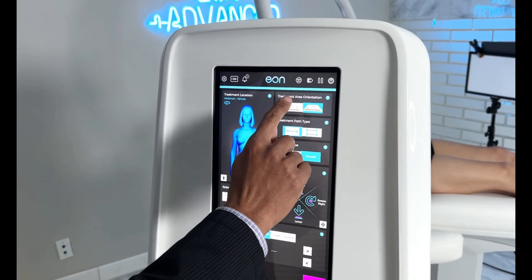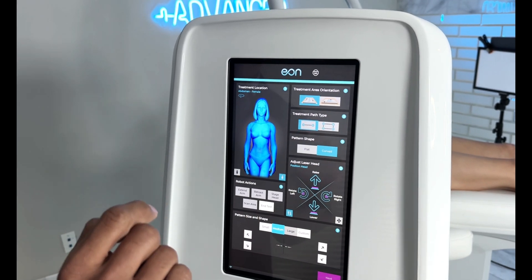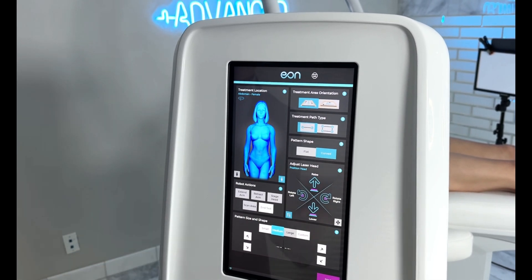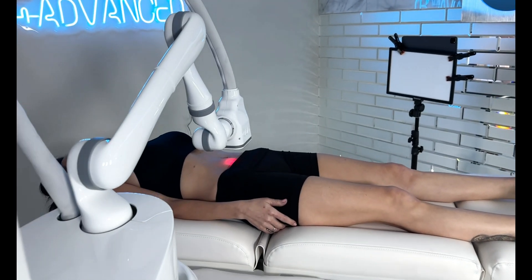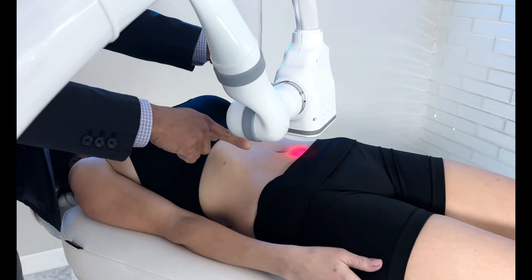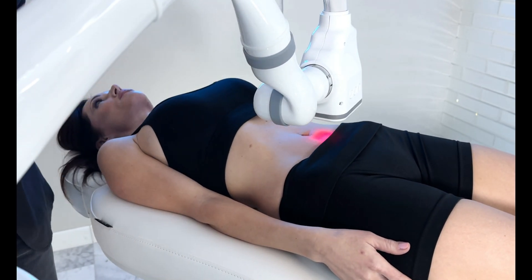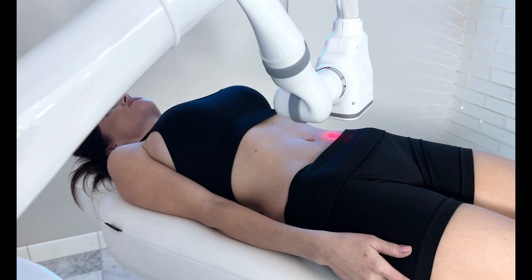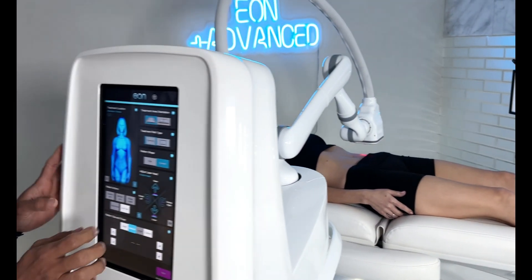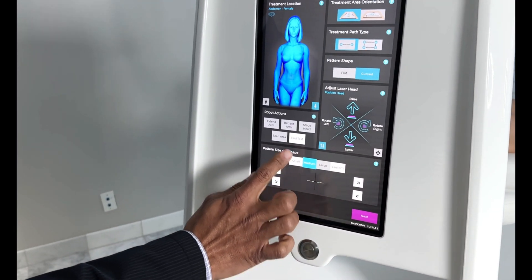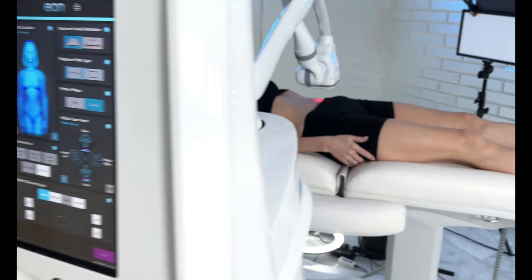I need to go the other direction and test the area. As you can see now, the treatment area is limited to that strip below our belly button. And because it's a little bit bigger than it should be, I'm going to make it smaller in real time without stopping — it's going to adjust.